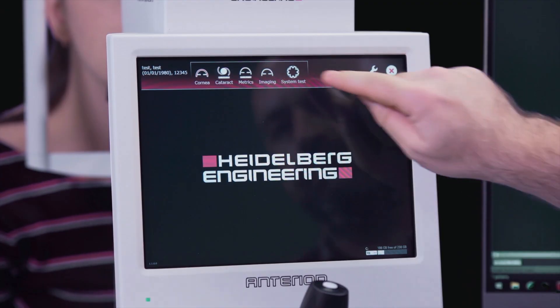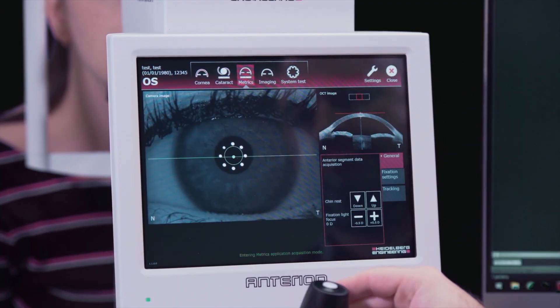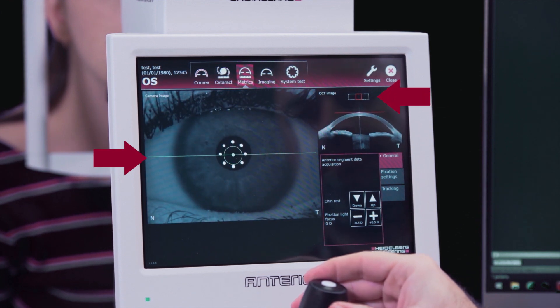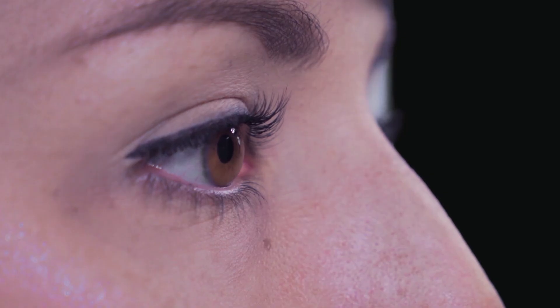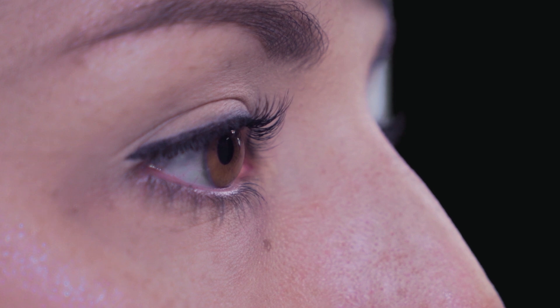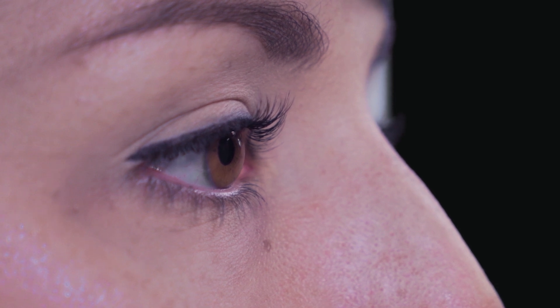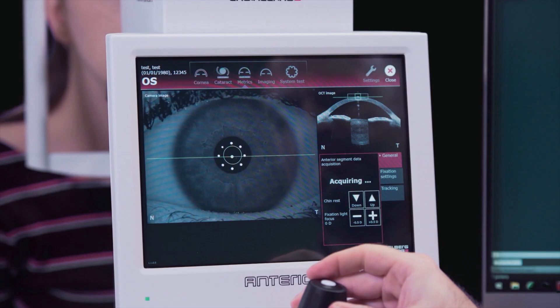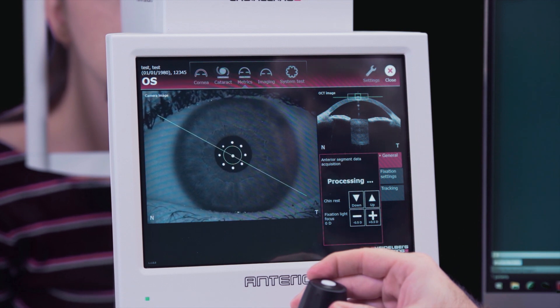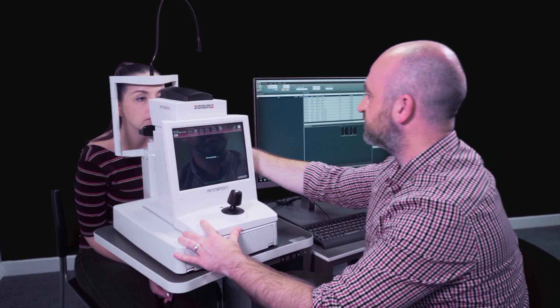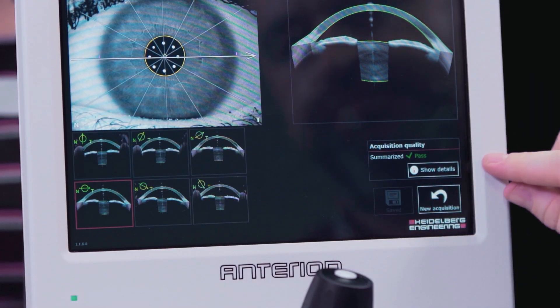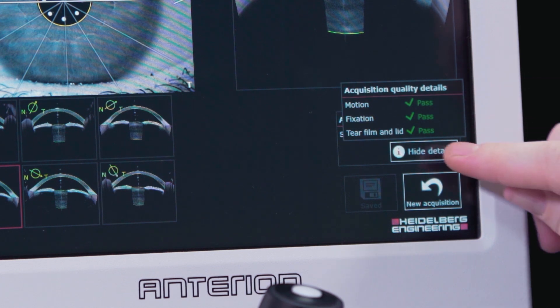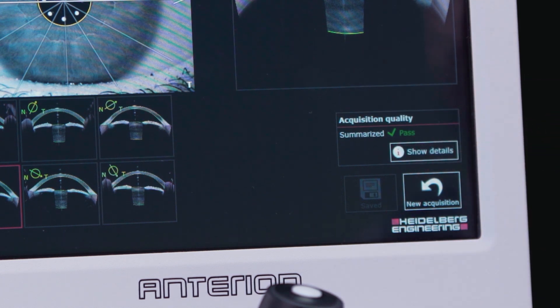Choose the Metrics app from the touch screen. Align the patient in the camera image and OCT image window until the horizontal lines turn green. Ask the patient to blink and keep their eyes open very wide for the Metrics app, and press the joystick button to acquire the image. Review the segmentation of the OCT section images before checking the acquisition quality summary, and repeat if required.